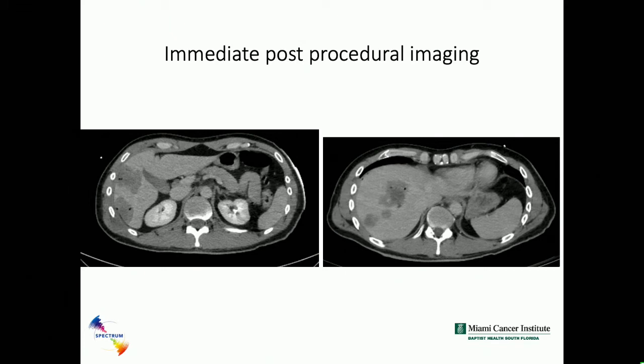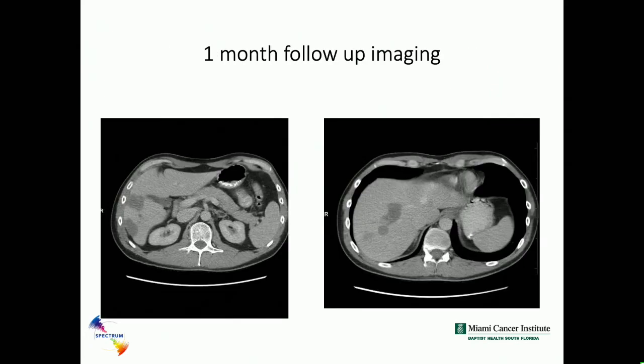Again, if you squish it, you can see the tumor and the margin and the black dots. That's where the needles were placed in respect to the tumor. Next slide, please. So this is the immediate post. Next slide, please. This is a 1-month follow-up. There's another follow-up on this patient, which I could not include in this, but we thought we'd gotten a good result, and that was also seen on the MR with the diffusion-weighted images and the enhancement characteristics.